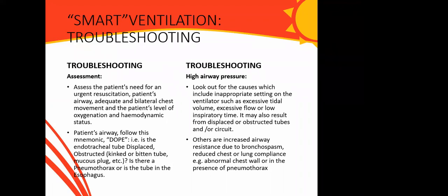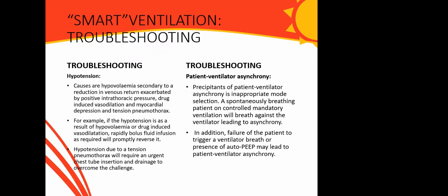All this may lead to increased airway pressure. All this may be due to bronchospasm. You could have reduced chest or lung compliance. You want to just troubleshoot and see how you can regulate what is happening.